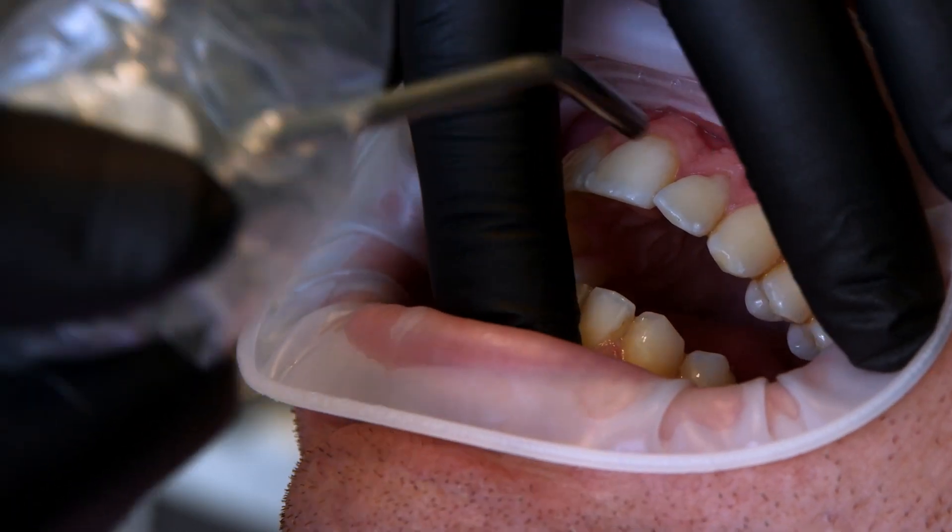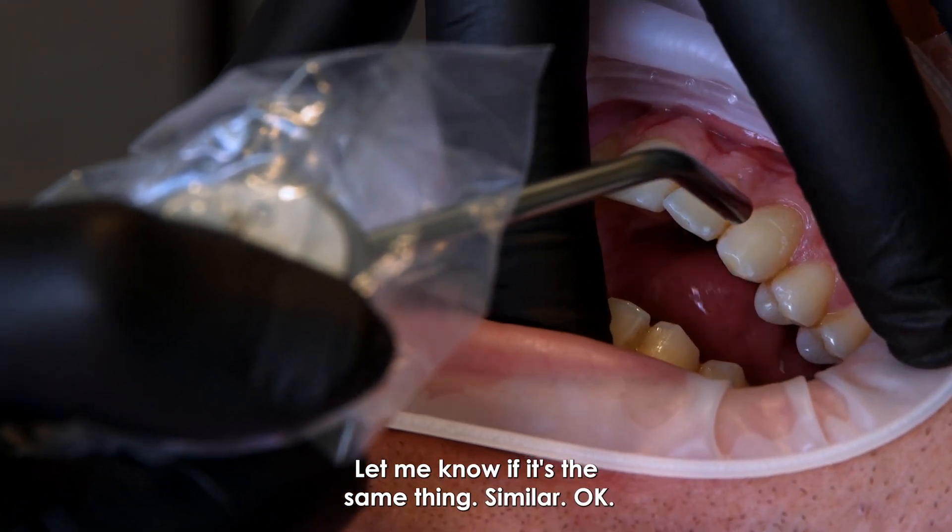Let's try the canine as well — the patient reports it's not a lot, similar to before.